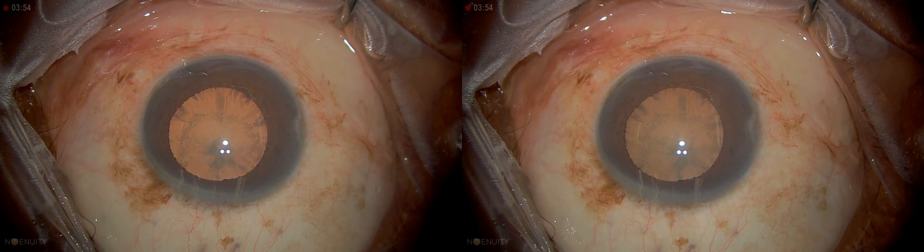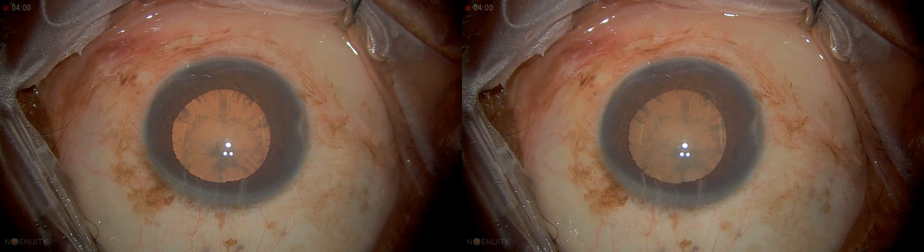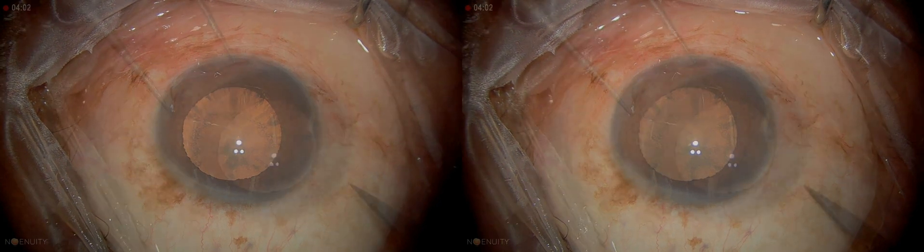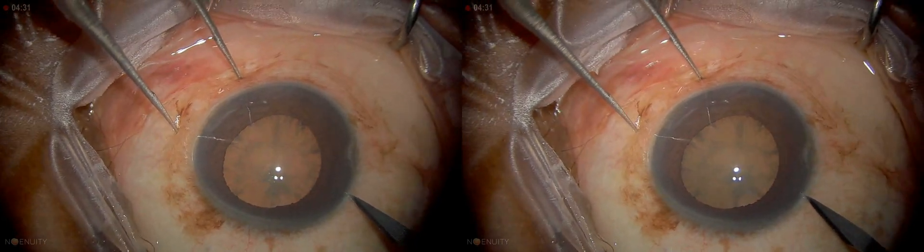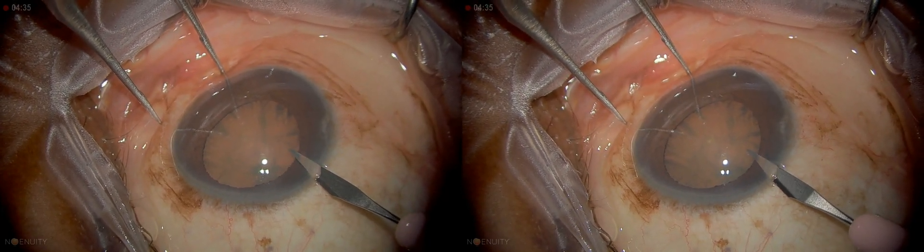54-year-old with a PSC cataract. You can see the pupils fairly well dilated — it's a relatively strong red reflex. When you start with the paracentesis, you really need a second instrument. I like to hold the second instrument against the globe here as a countertraction.